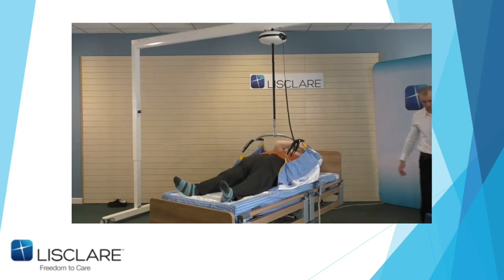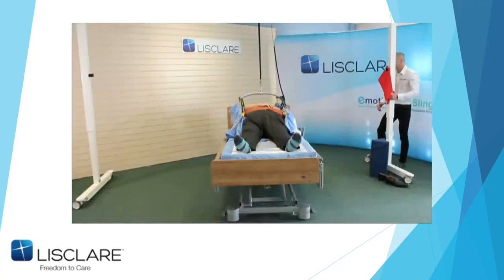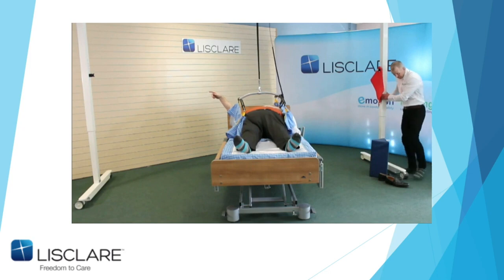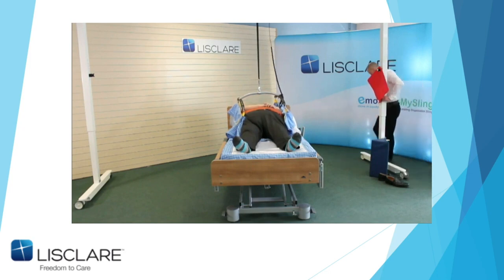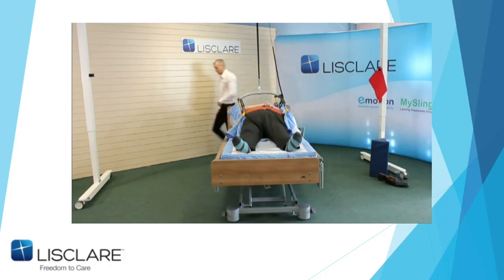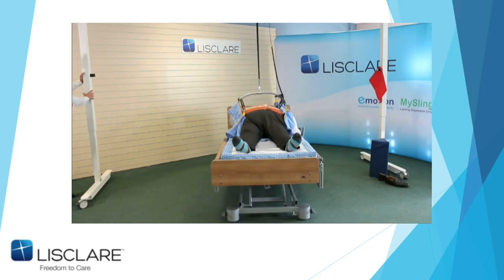John, if you move that left-hand side up, and put the brakes on. Keep going, John, until you look at the angle. That's you. And then he's going to put the brake on that side and move the gantry up on that side. Now you could, obviously, if the gantry is a fixed hoist, move the bed once you've lifted me, okay?